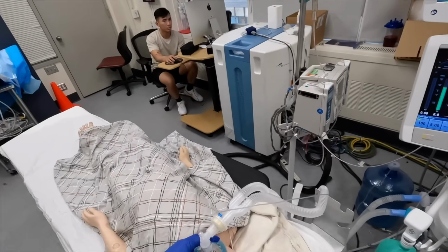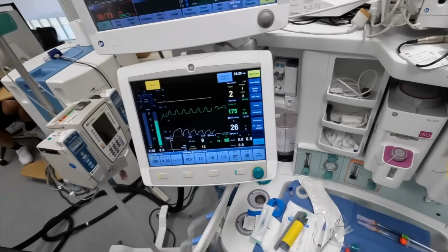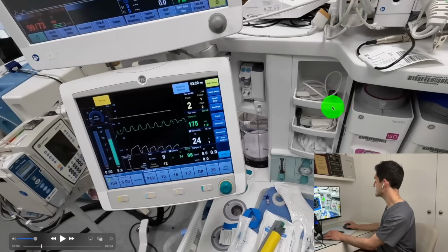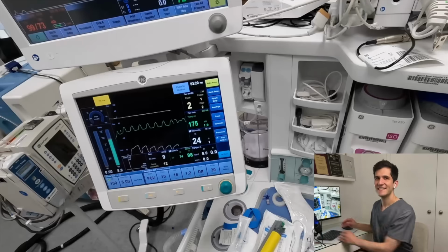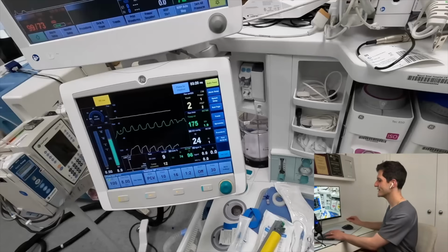And astronauts say pretty commonly that as you get ready for blast off, it can start to get a little smelly. So I mentioned getting a little smelly because I'm just turning on the anesthetic agent here, which you can see with my right hand, I'm turning the dial for the sevoflurane. It's not a terrible smelling medication, but it is described as being a little pungent. So if you don't warn a patient that they're about to smell something that's a little funky, then it can be disconcerting. So I like to include this as part of my rocket ship theme and just say that it's the rocket fuel, and that's all that they're smelling.